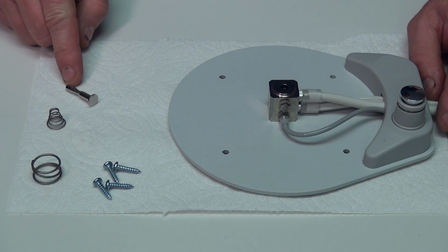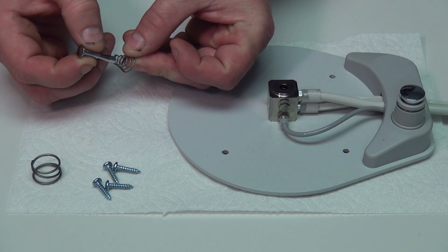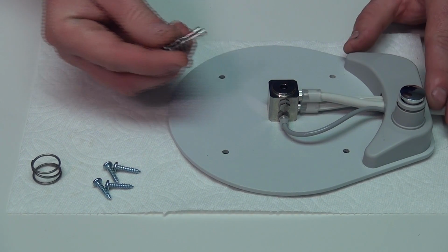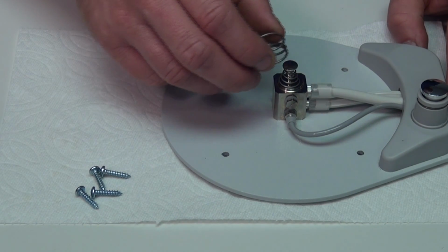Next, we're going to take the piston with the flat top pointed up, insert it into the small side of the spring first, then insert onto the pedal. Next, we want to follow that up with the larger spring.